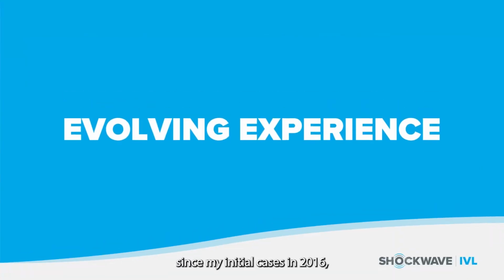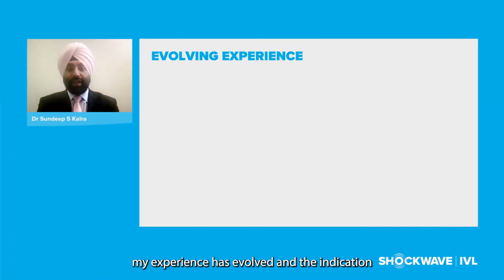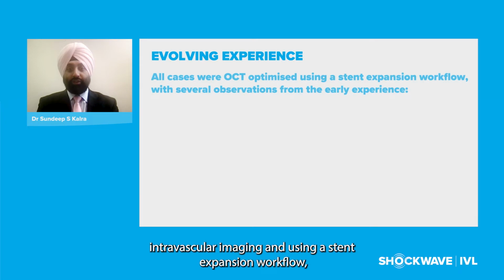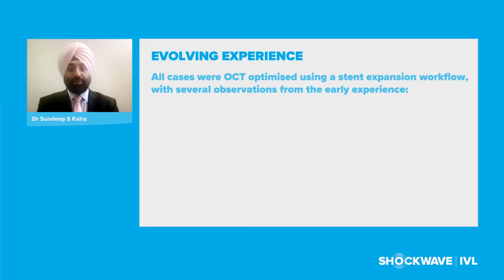Since my initial cases in 2016, my experience has evolved and the indication for my use of Shockwave IVL has changed as well. All of the cases I've undertaken have been optimized using OCT intravascular imaging and using a stent expansion workflow, and there have been several observations that I've made from my early experience.